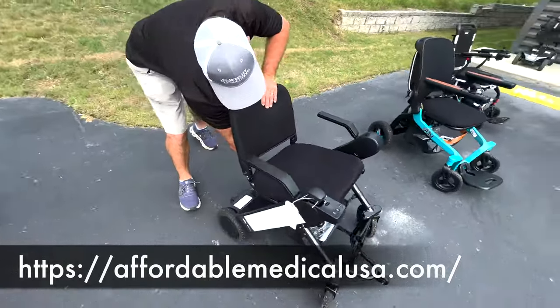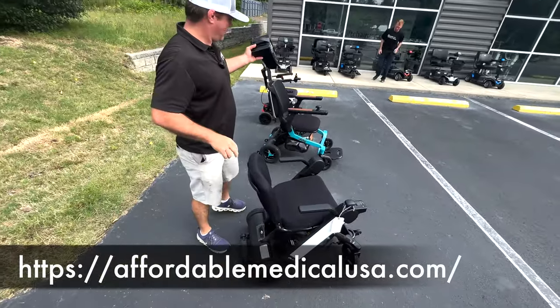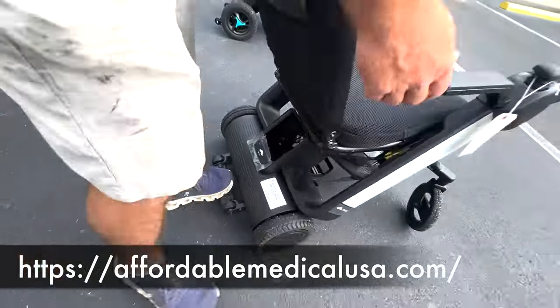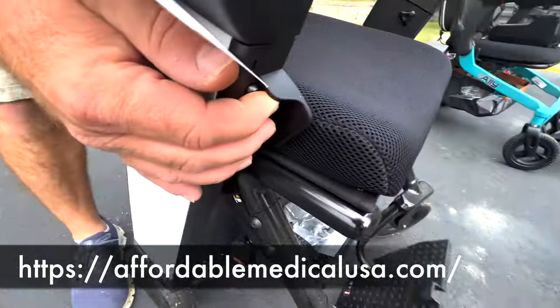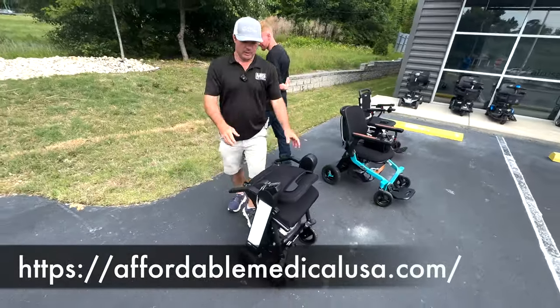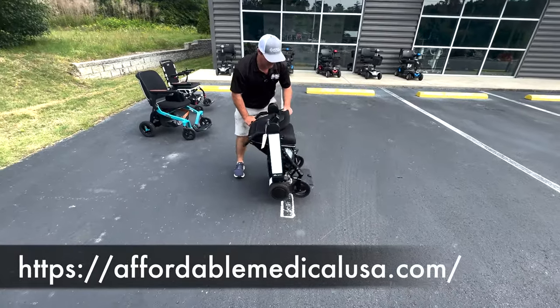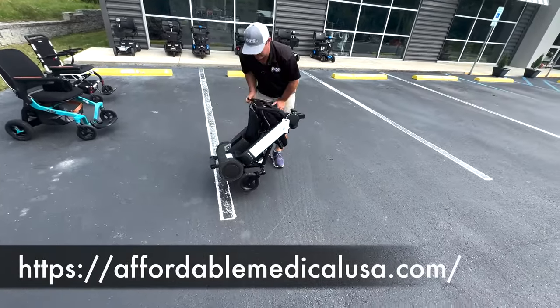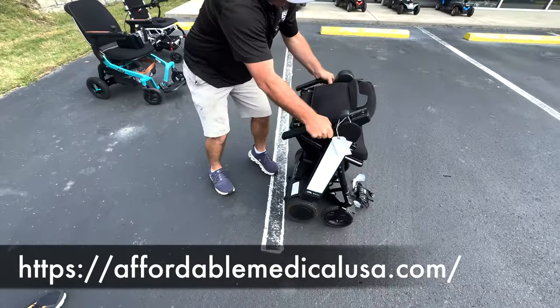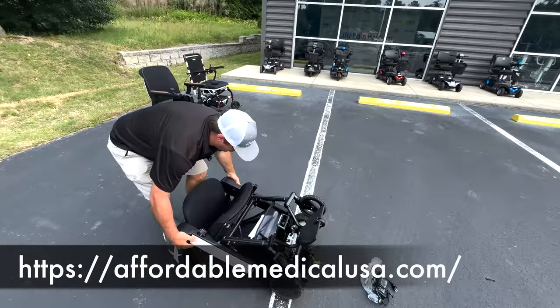So how to fold the FI up. If you want to reduce the battery or the weight, take the battery out, put that to the side. You're going to come here with your foot. There's a latch back here. And then this is folded up. Okay? So this can be rolled. You can put it into the car on its back if you want to, on its front, like so, on its back, like so. That's how you can travel with it, or you can keep it standing upright.